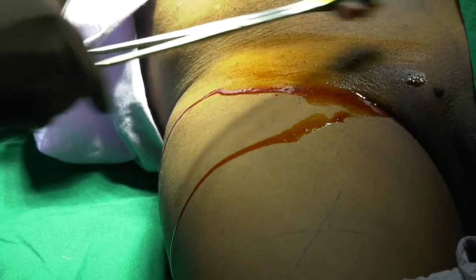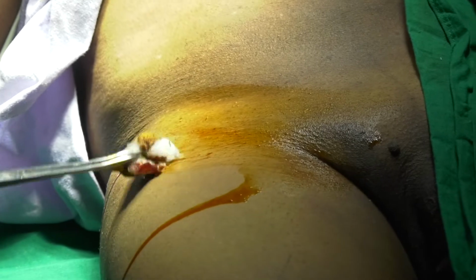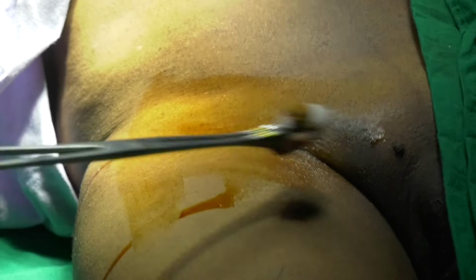The landmarks for the fascia iliaca block: measure the distance, lateral 1/3 and medial 2/3, and go 2.5 centimeters below that.